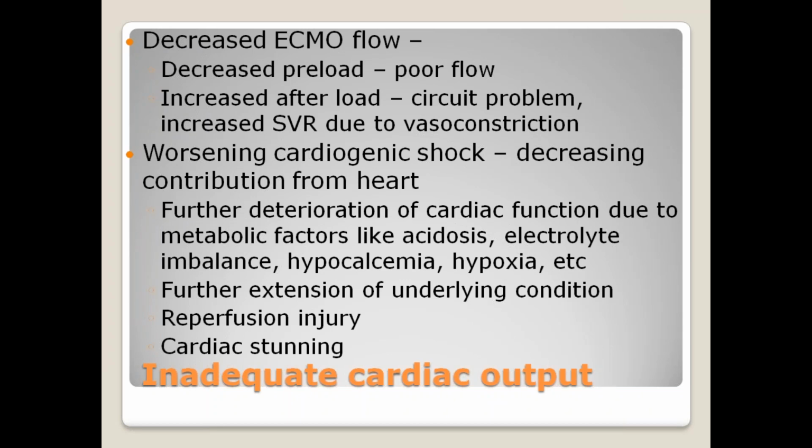That ECMO flow can be decreased because either the preload is inadequate, or there is something wrong with the circuit, and that's the reason the flow is decreased. That is whatever we discussed about poor flow. Or the increased SVR due to vasoconstriction can lead to decreased flow. Okay. It means whatever flow you are giving is not sufficient for that patient, and you have to go up on that flow. Another cause is worsening cardiogenic shock. So when you started ECMO, you were doing well with 3 liters of flow.